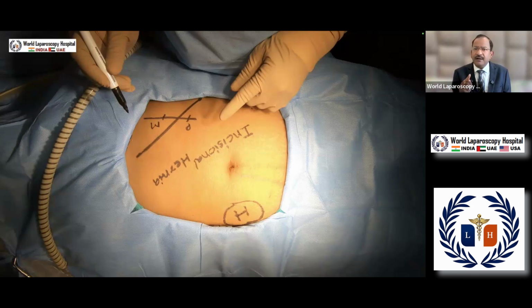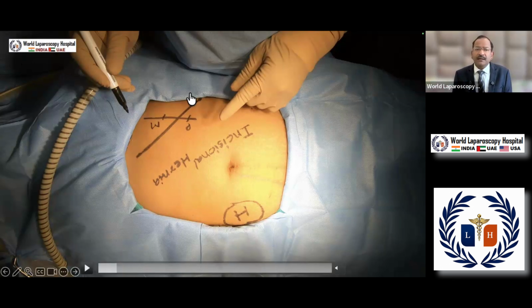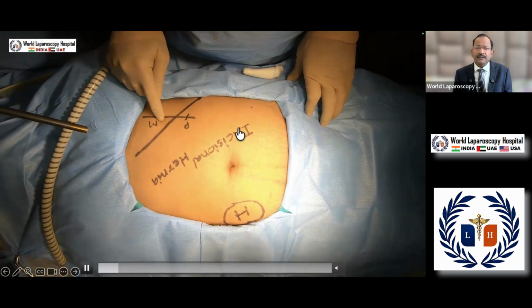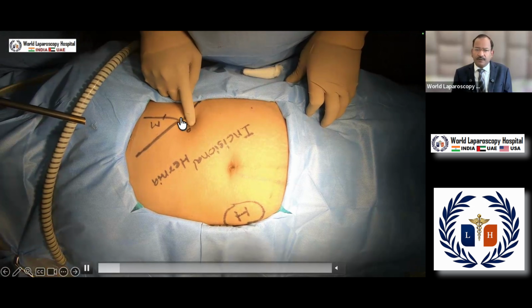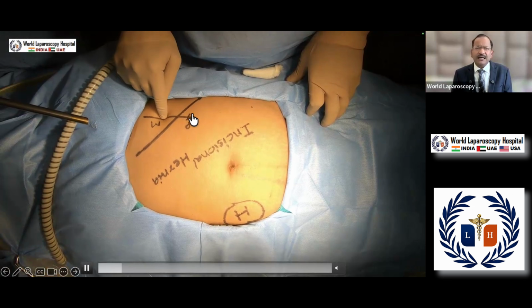But it is very important here also, a nasogastric tube is a must, and in splenomegaly, you have to stretch it down. So, how to stretch it down? It is nothing very peculiar, it is just a stretched Palmer point. Mishra's point is a stretched Palmer point. So, how to do it? We will see that. This is Palmer's, this is Mishra's, this is the costal margin, and here is the incisional hernia. This patient has a hernia. So, this is 3 centimeter below the costal margin, and this is 2 centimeter above the costal margin. Some books say 2 for Palmer's, some write 3.